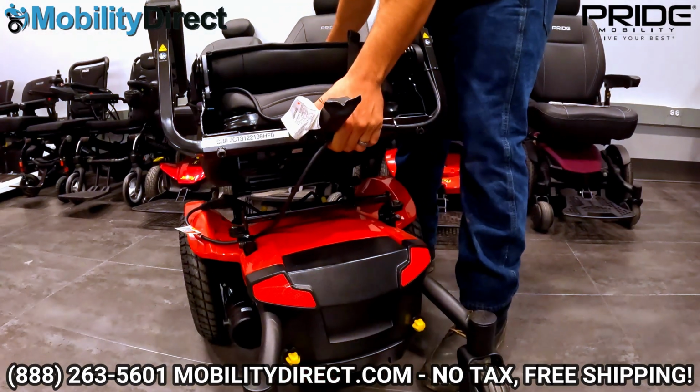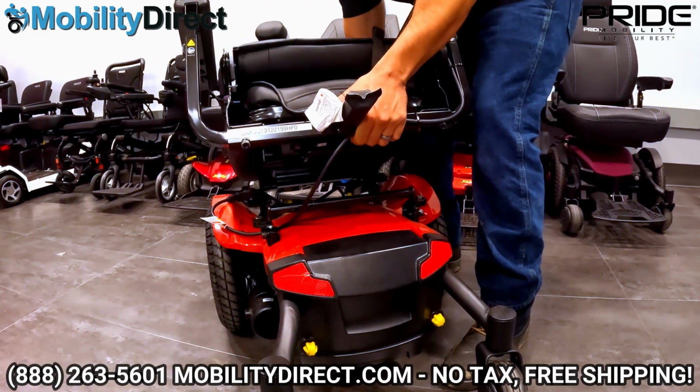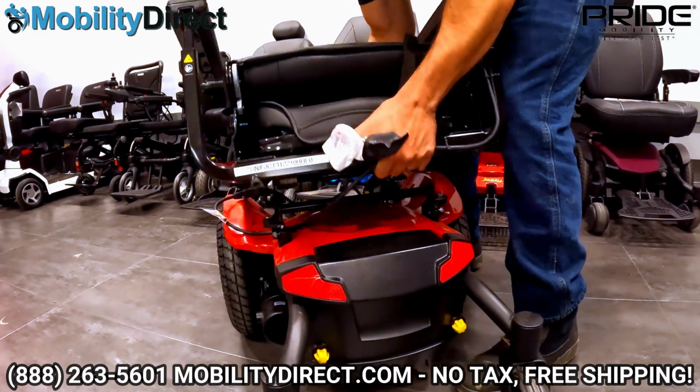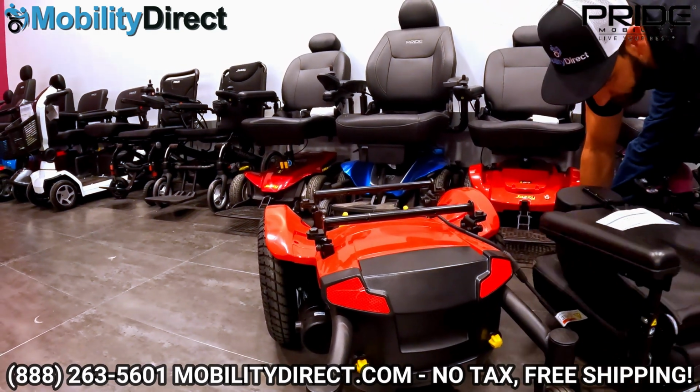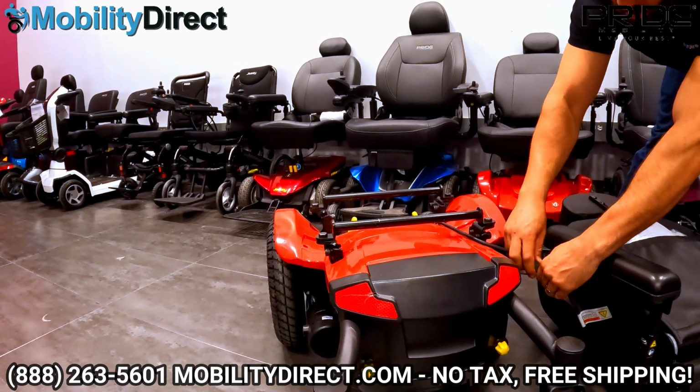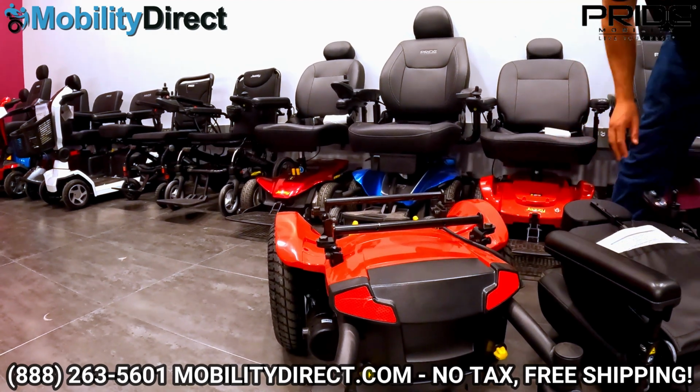After that, you want to grab from the bottom part of the front of the seat, pick up, and back. Now we have it disconnected. Of course, you want to disconnect this cable as well, which is for the power to the joystick.